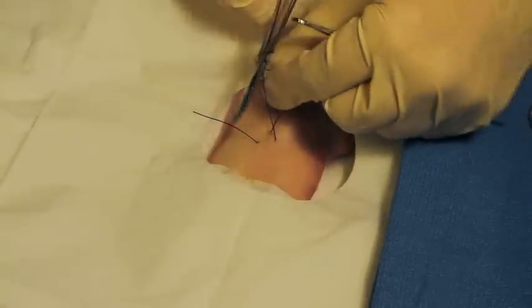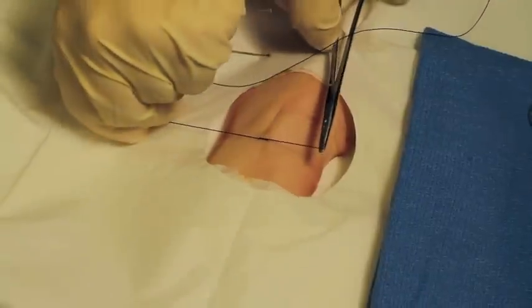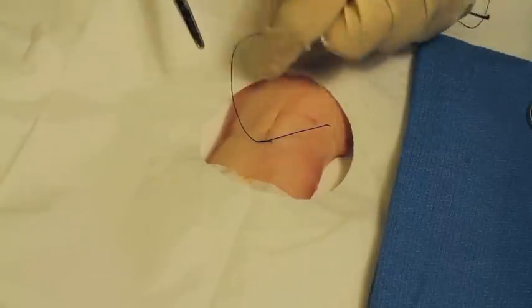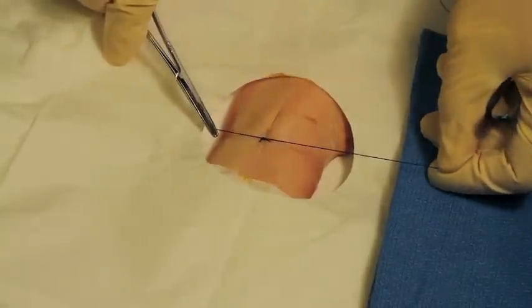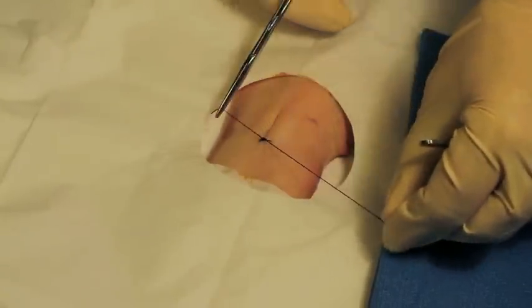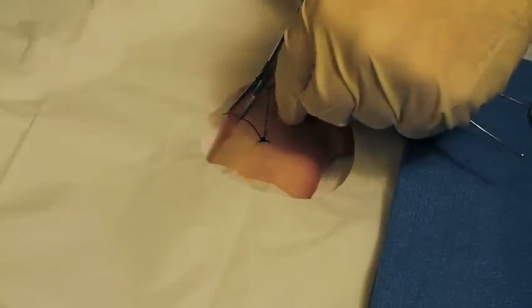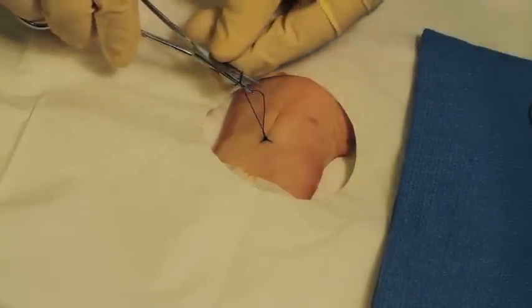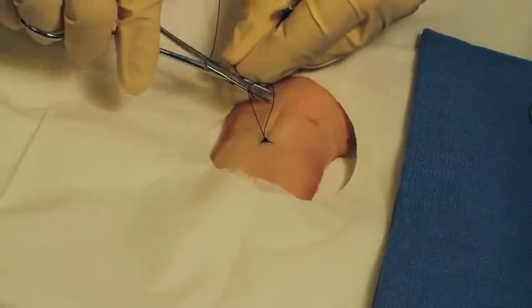Now we're going to do something called an instrument tie. We're going to twist and make a loop around and make our first knot. Grab the loose end of the string — make a loop, grab it, pull, and grab the loose end of the string and pull it through the loop. Keep doing that four or five times. There you go — you've made a stitch!